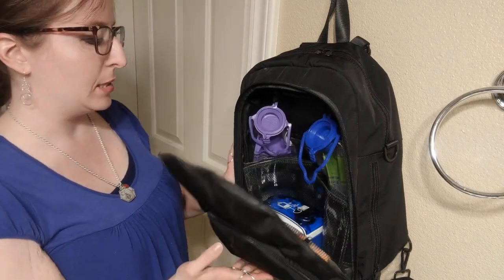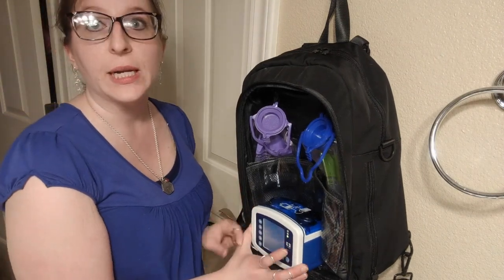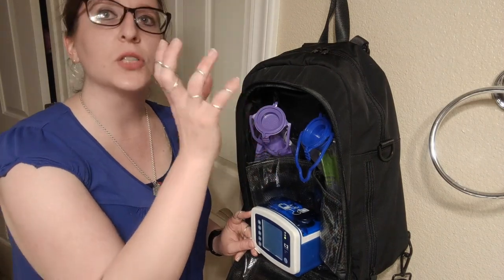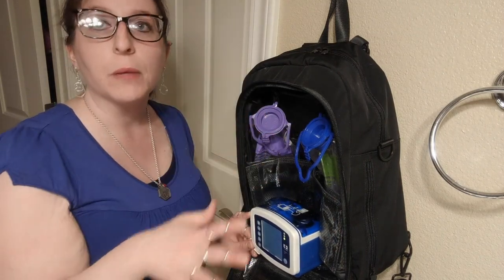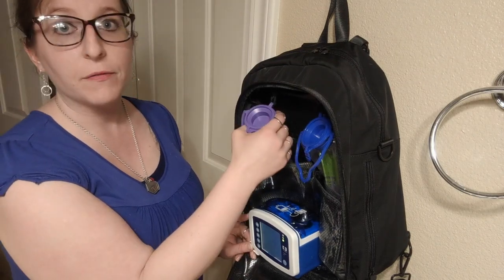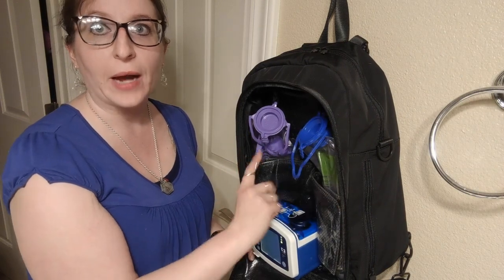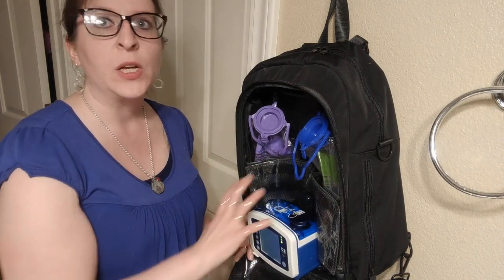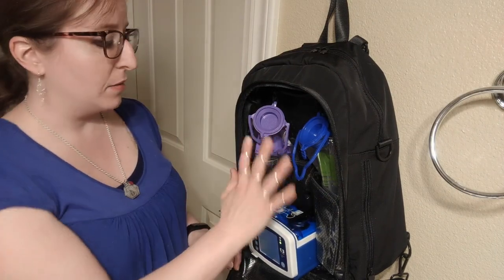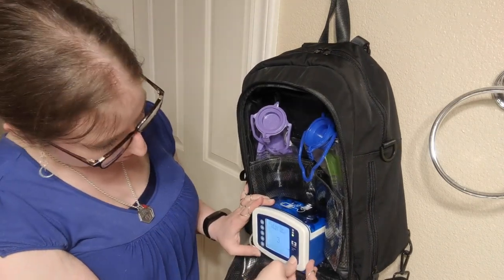My pump is this Joey pump, and the thing about the Joey is that, unlike the Infinity pumps and some of the others that have just the feed, this has the feed, and then it has a flush and will automatically switch back and forth between the two at certain intervals, and you can program the pump to do that. So this is the end of this feed. As you can see, the bags are pretty much empty. So I'm going to turn the pump off.